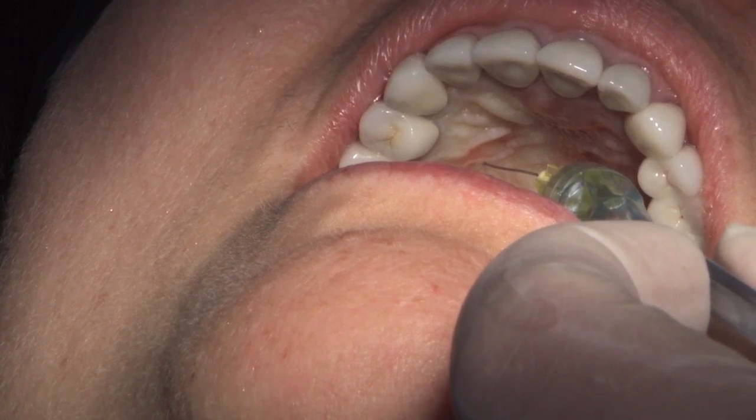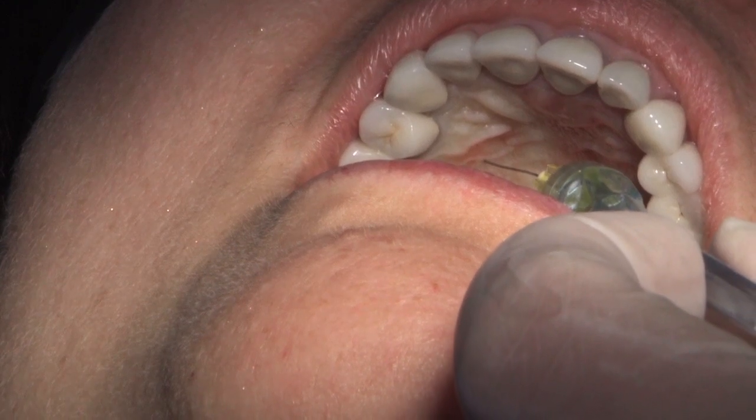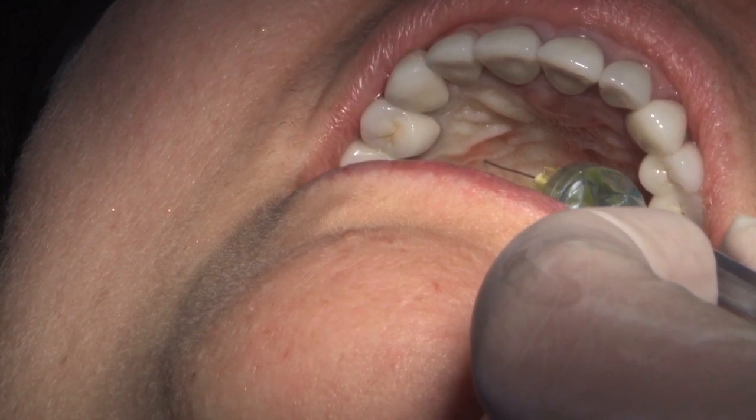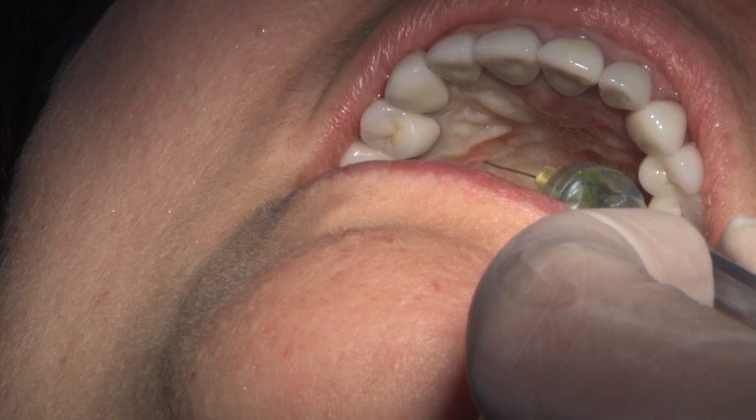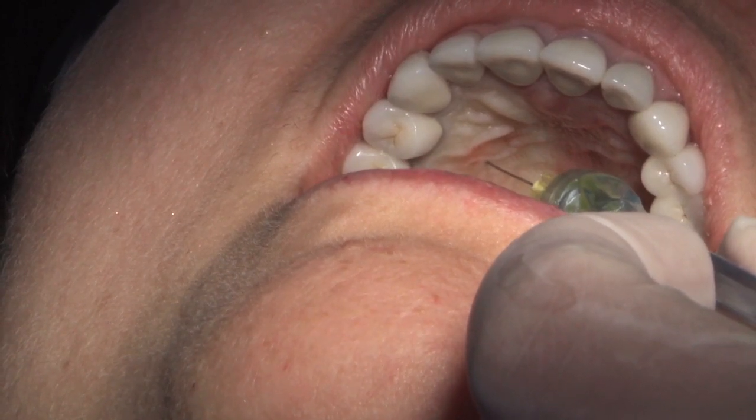She looks pretty good, and we could probably stop deposition at this point. We've got good blanching — go ahead and lift to the side after you withdraw and let's see if we've got it.